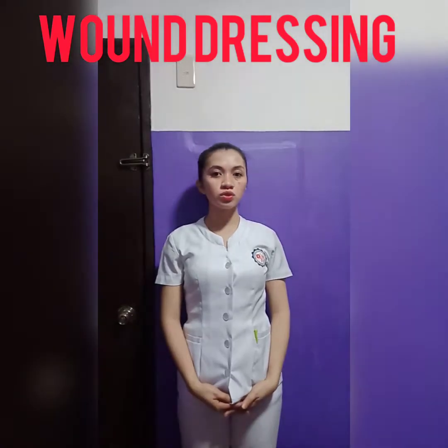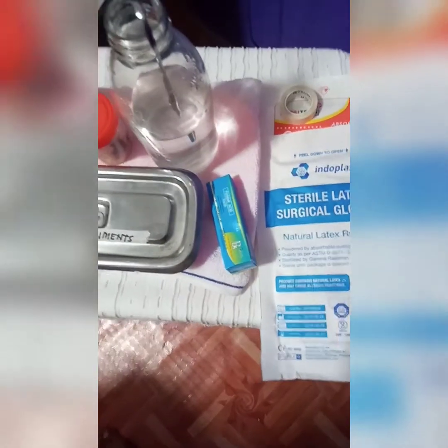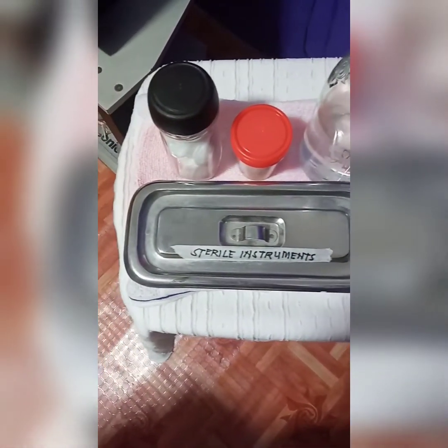And now I'm going to do the medical wound dressing. First is to prepare needed equipment. Then, wash your hands to prevent any infection and maintain sterility.